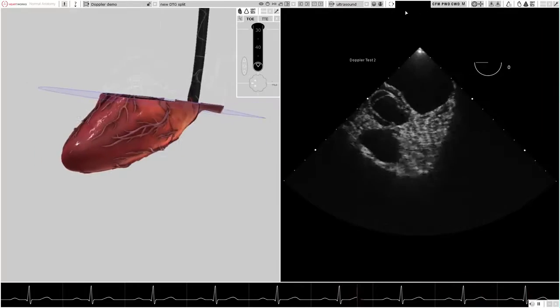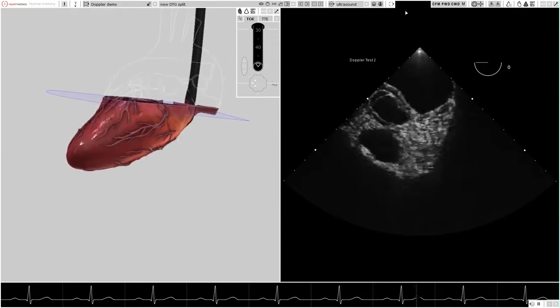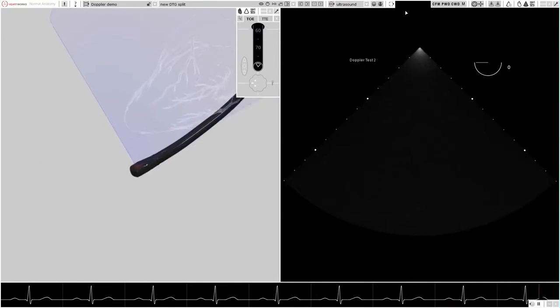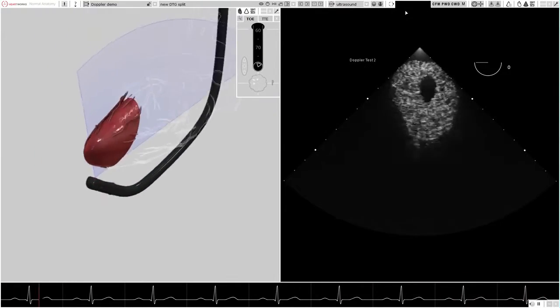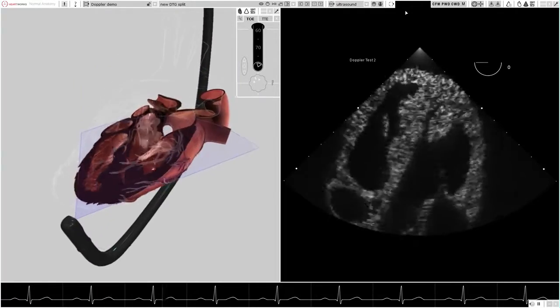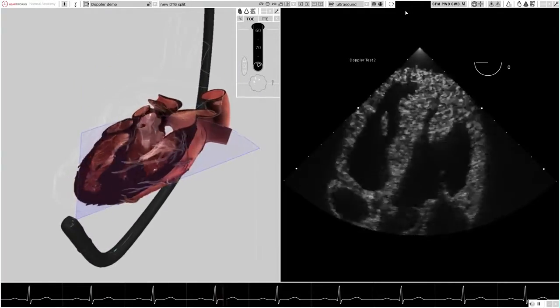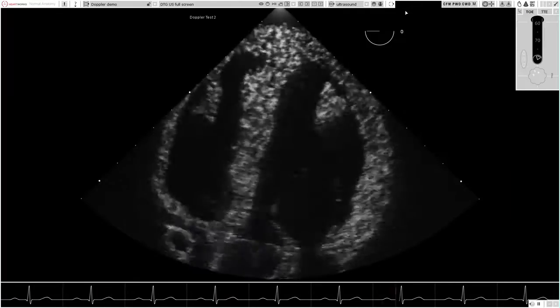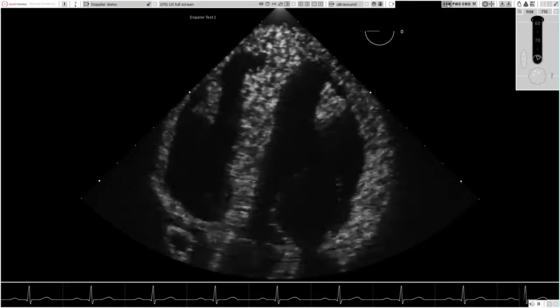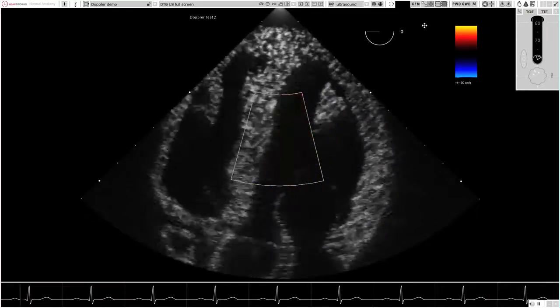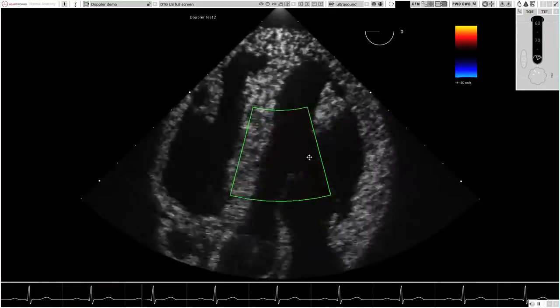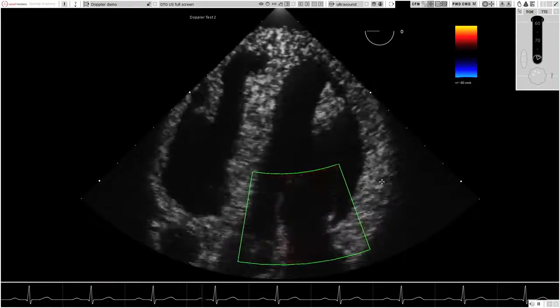Changing the direction of the incident Doppler signal — for example when TEE imaging progresses to deep transgastric imaging — results in an accurate real-time change in the color and spectral displays to represent the change in relative direction of blood flow.